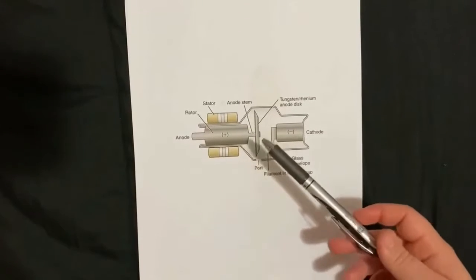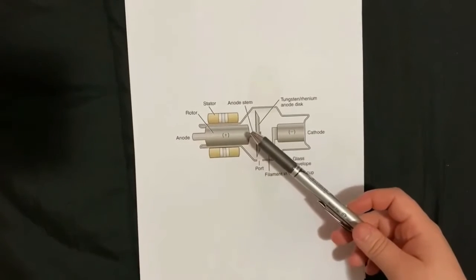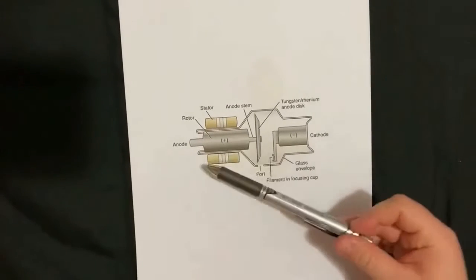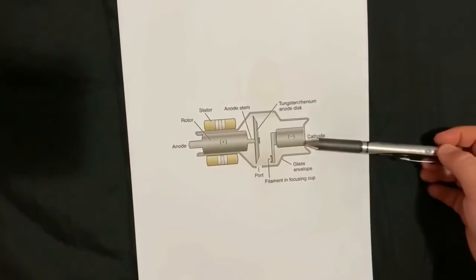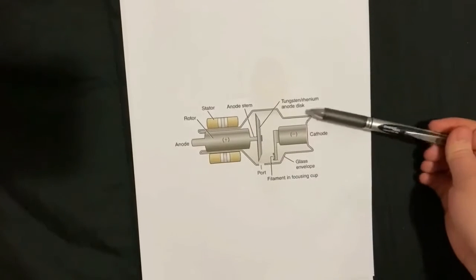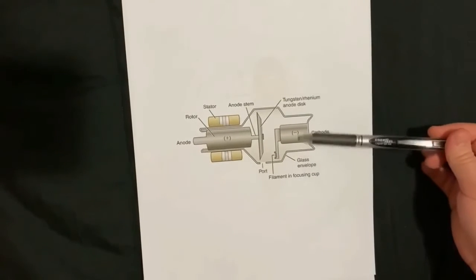This is a diagram of the X-ray tube, and its main function is the production of photons. It consists of an anode side and a cathode side. The anode side is the positive one and the cathode is the negative. The cathode side consists of two parts.